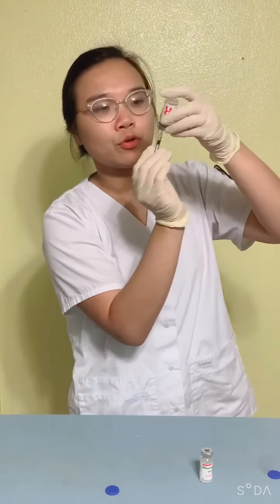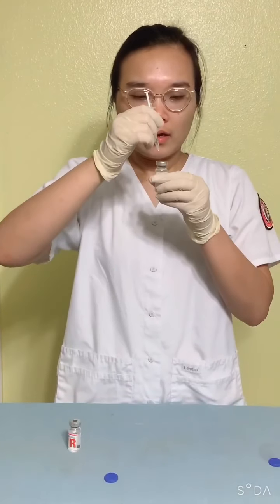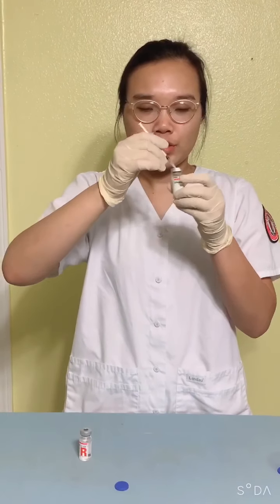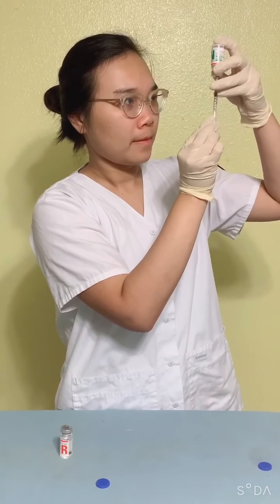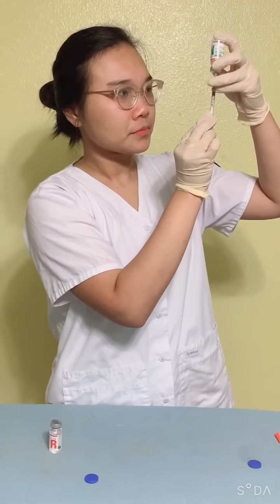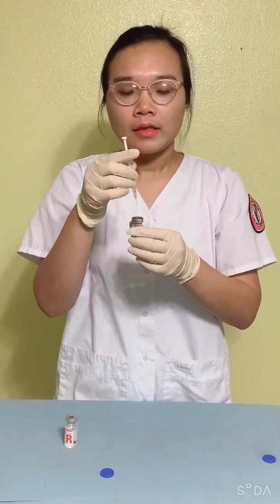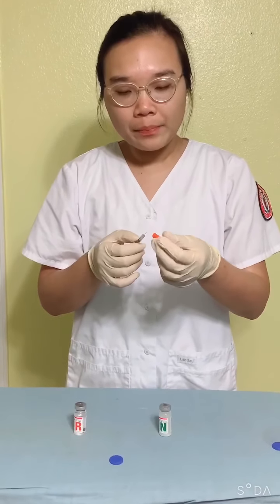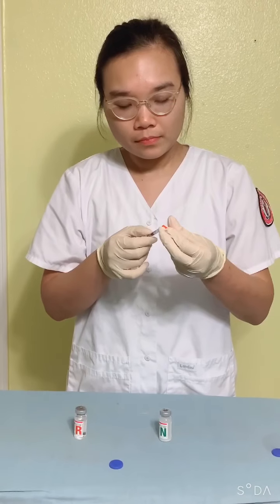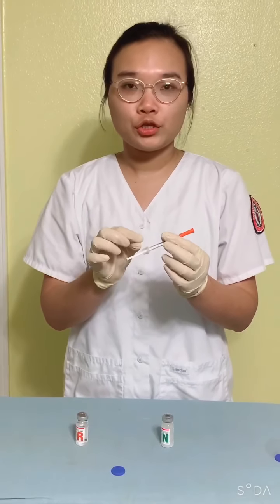Now I am going to withdraw the needle and insert it back into the NPH and withdraw the dose of medication. And then I would withdraw the needle, safely cap it, then I would label the syringe and verify it with the second nurse.